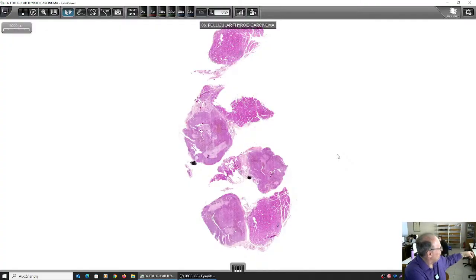If the nodule takes it up, it's hot. If it doesn't take it, it's cold, and it's more likely for it to be malignant. More likely. It's not certain. We are the ones to judge the malignancy, not the radiologists and the nuclear physicians. They don't know. We only know. The pathologists know everything.